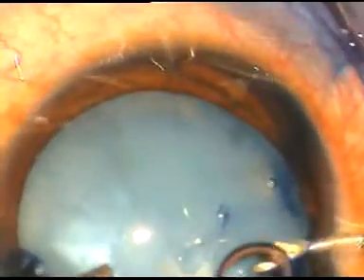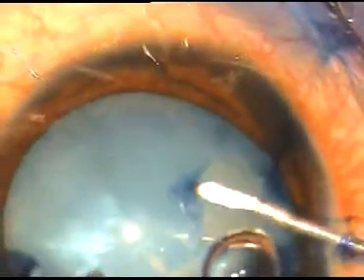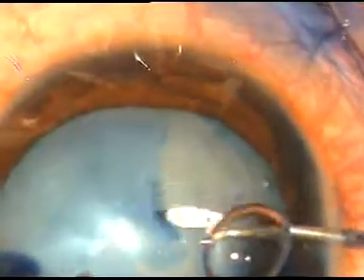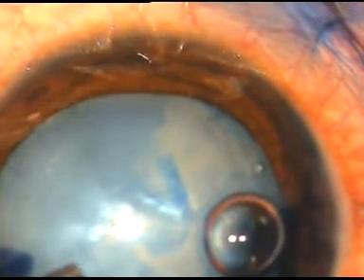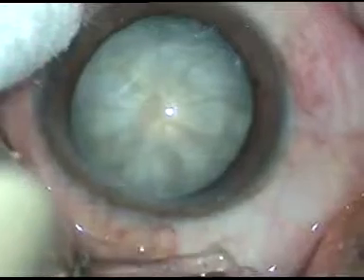Dear colleagues, in intumescent cataracts, if you don't do mini rhexis in intumescent — if you try to do rhexis on the go — this is what may happen. In this case, the rhexis has run out. It has gone underneath the iris. To avoid this, what I do is, in intumescent cataracts, I do mini rhexis in intumescent.